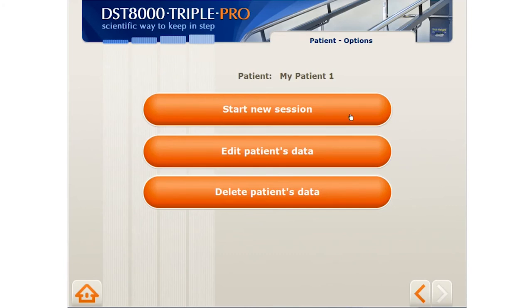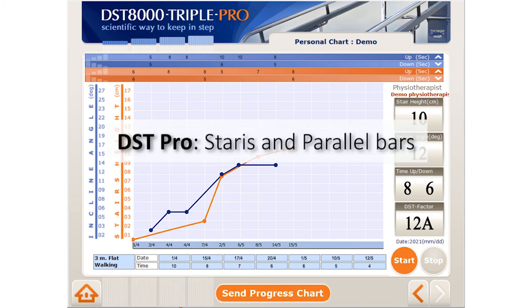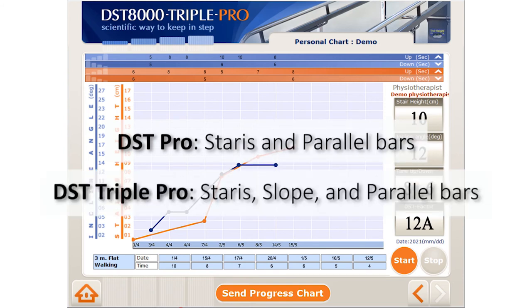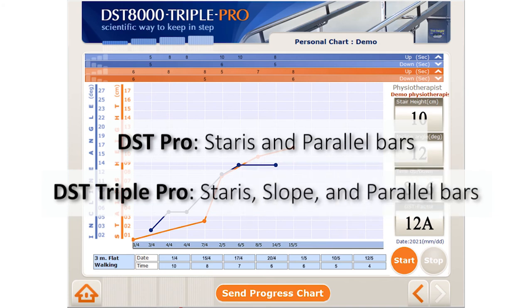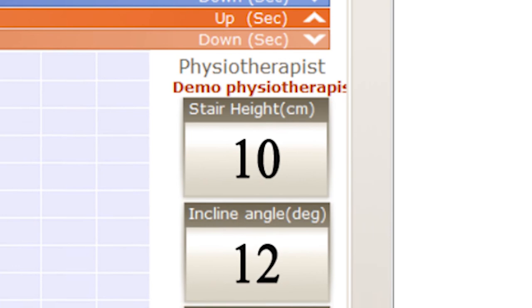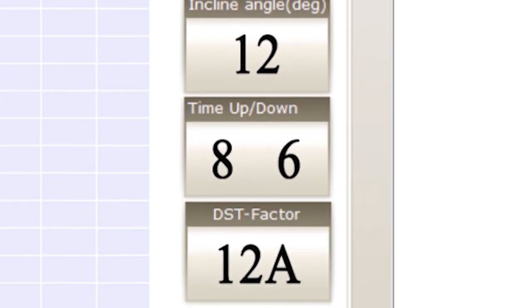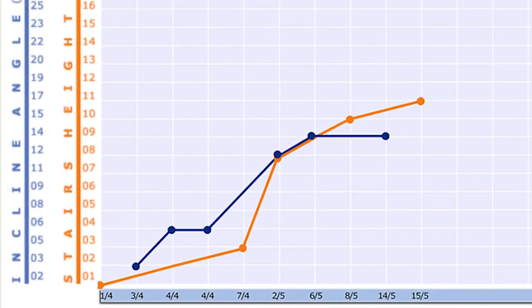To start the session, click here. This is the patient's personal progress chart, and it is the heart of this software. If you have the DST Pro, you will see data for stairs and parallel bar practice. If you have the DST Triple Pro, you will see data for stairs, slope, and parallel bar practice. We have the patient's name, PT's name, current stair height and slope degree, and the time it took the patient to go up and down on the last practice. Each session is recorded by its date.